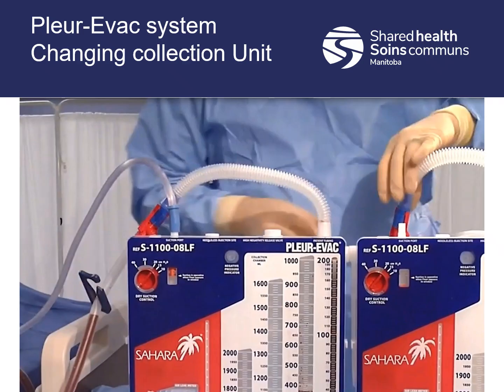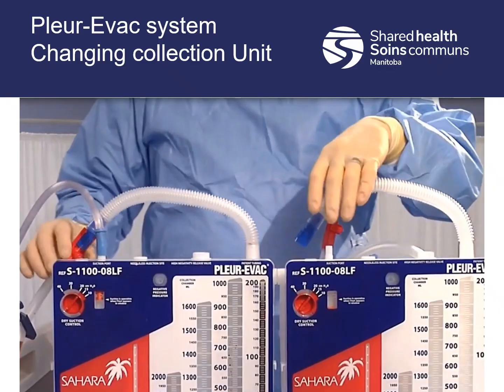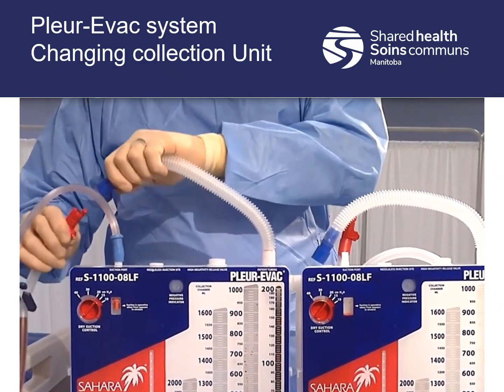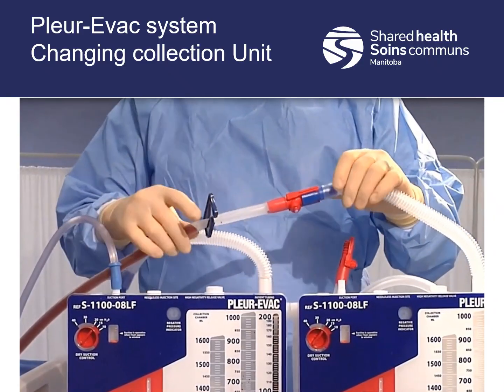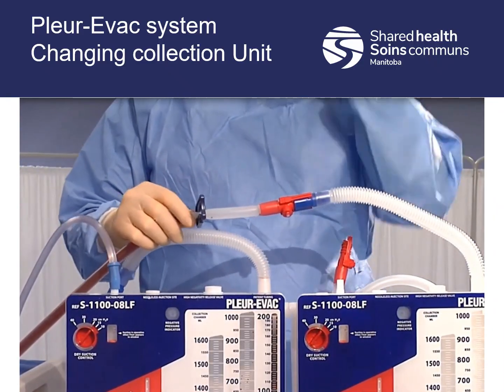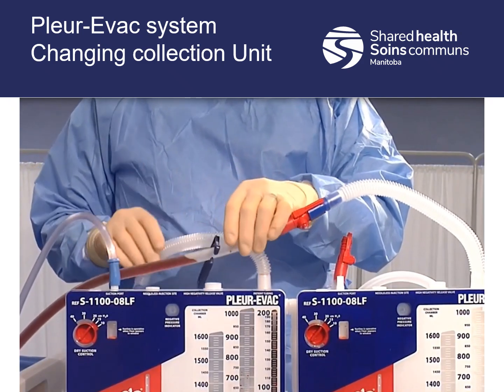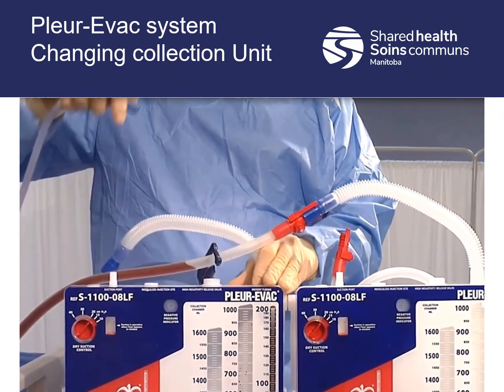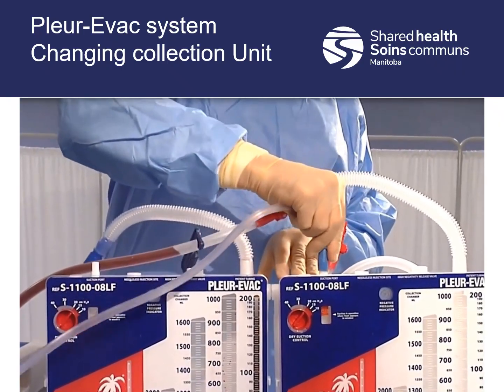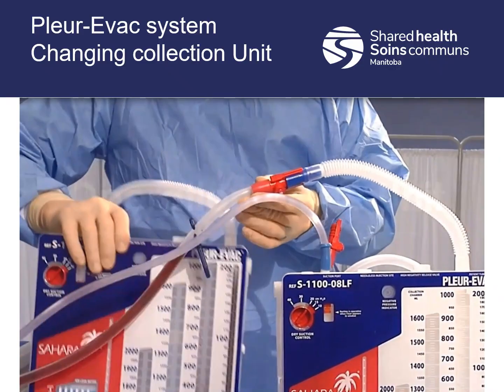And then we're going to separate the red and blue connectors on the new Pleurovac unit. You can see it like that. We're going to take the tubing from the patient and just clip it into our new device. Then we're going to unclamp it. Then we're going to take our suction and again double check to make sure it's as prescribed if we are using suction. If you're not, then you don't need to worry about this step. Then we reapply the new suction, again making sure that the valve is at the top and it says yes on the pressure control indicator.